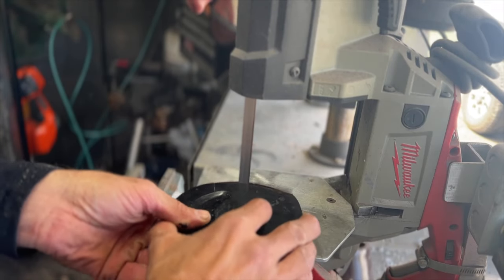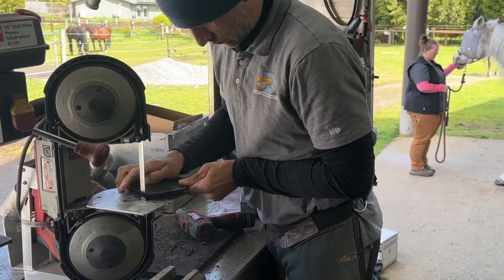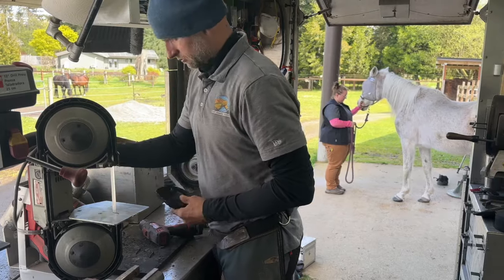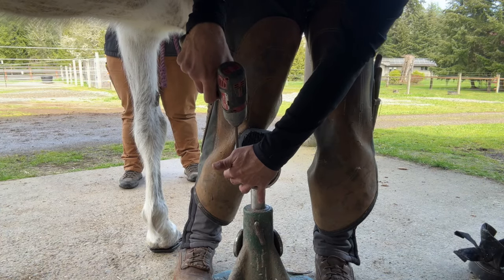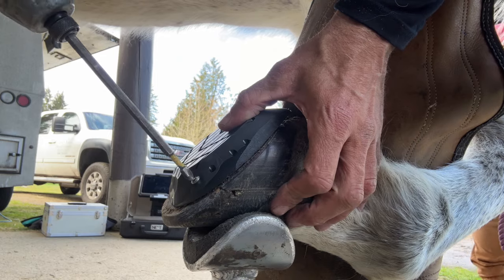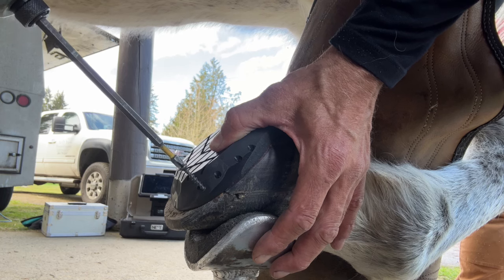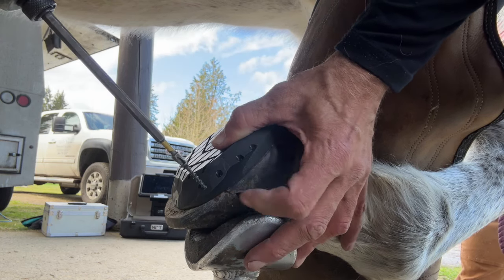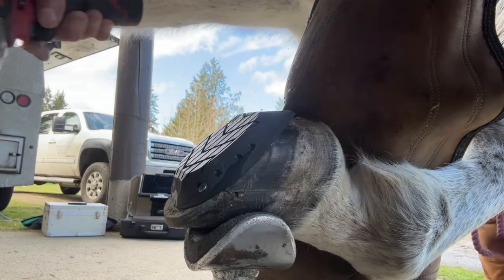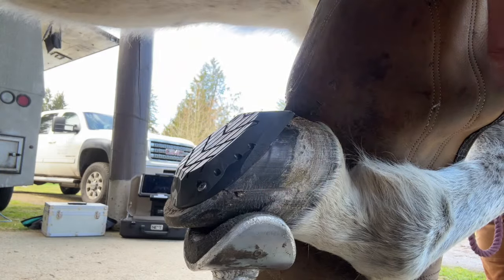While we didn't end up applying the right front shoe, I still went ahead and built it so we could apply it in a week or two. See how my clog is coming up above the shoe here? See how it's not flush? If I try to keep sucking it down, it'll strip out the hoof wall. So I back out the screws, see how it got flush with the foot? And then it sucks it down. So you start it, back it out, drive it in.